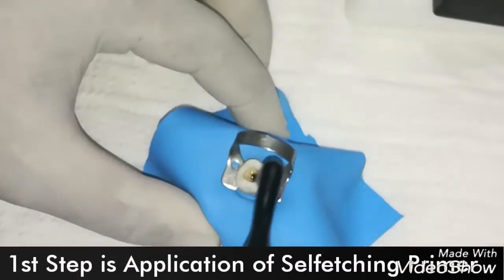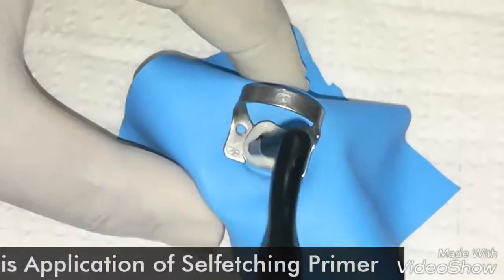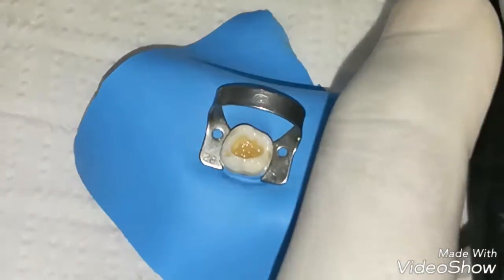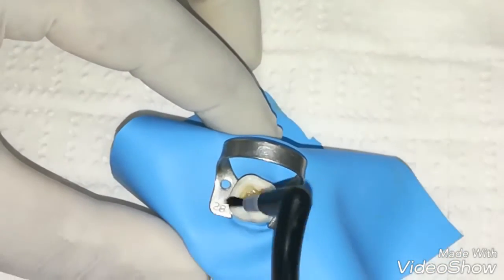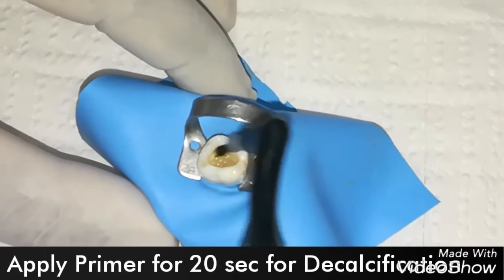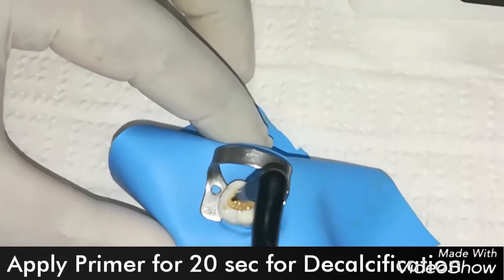We use the primer on both enamel and dentin perfectly, and just rub the primer on each and every part of the tooth for 20 seconds. This self-etching primer mildly etches the enamel and forms micro and macro tags, which act as channels for better penetration of bonding agents.